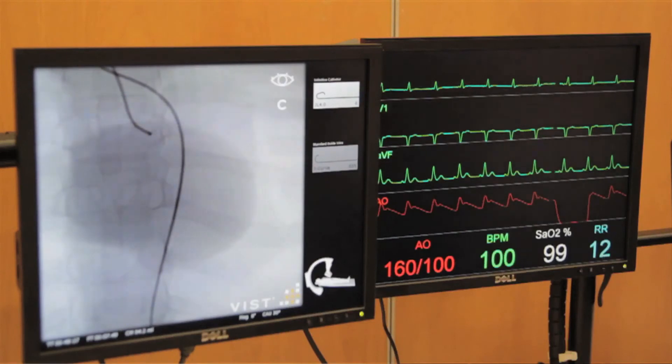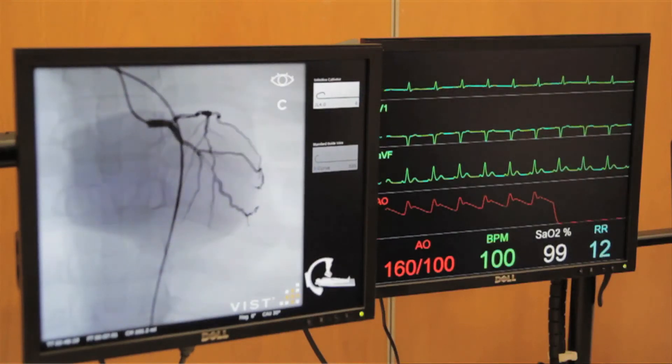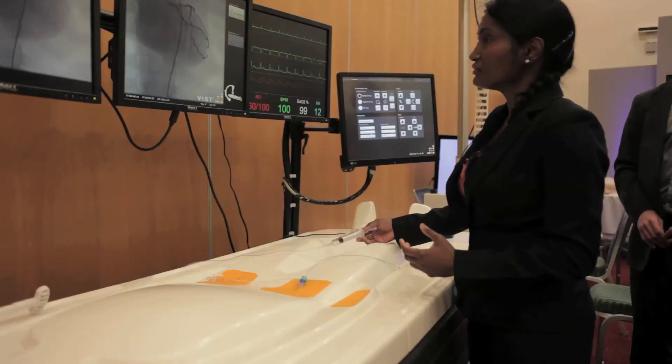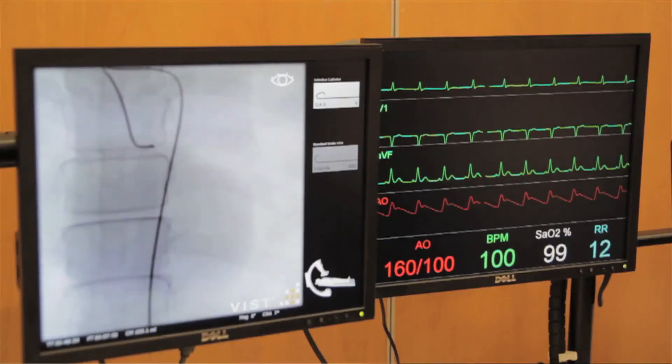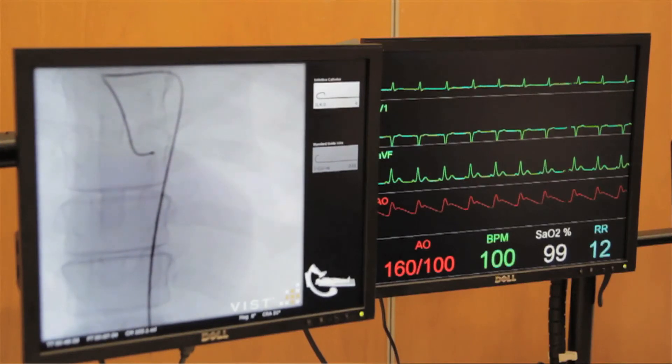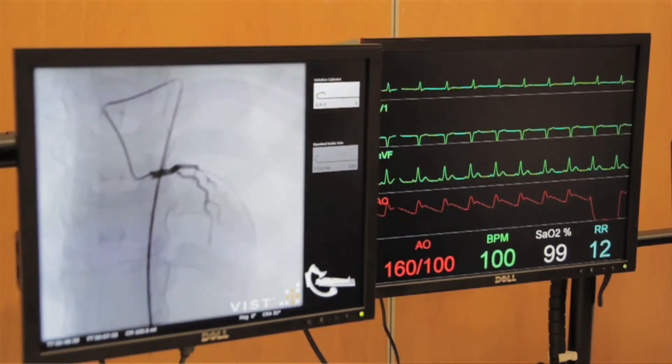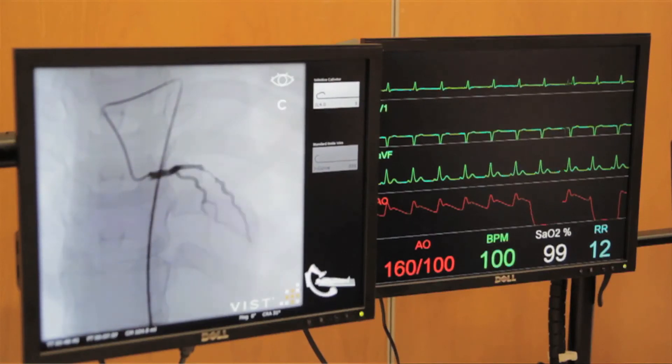So it is essential to look at the coronary artery in different angles so that we do not miss the stenosis. We will now go into the PA cranial view. And again, gentle test to ensure you are within the left main stem and then acquire the image.